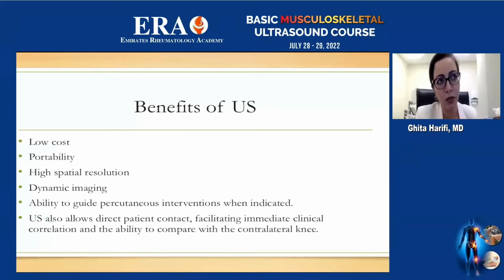Another advantage of ultrasonography is that it allows you to proceed with ultrasound-guided injections, which have been shown to be much more accurate than blind injection. Ultrasonography also allows direct contact with the patient. It does allow you to show the patients what's going on as you're examining.